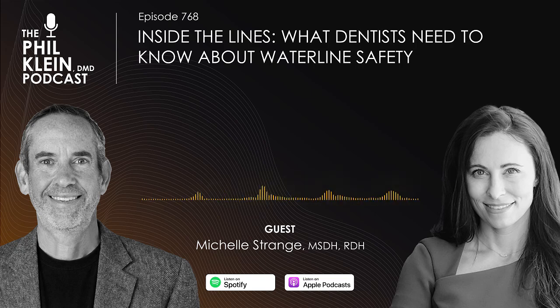And if you're like, no, less steps the better, then I think it's easy. You can start finding those compatible products. And then the final piece would be, I'd say, all right, what are we going to do with our rhythm for testing? We know if we haven't been doing anything at all, 3 passes, a must. But is that going to be in office, or is that going to be a lab? And then what are we going to do consistently after that?